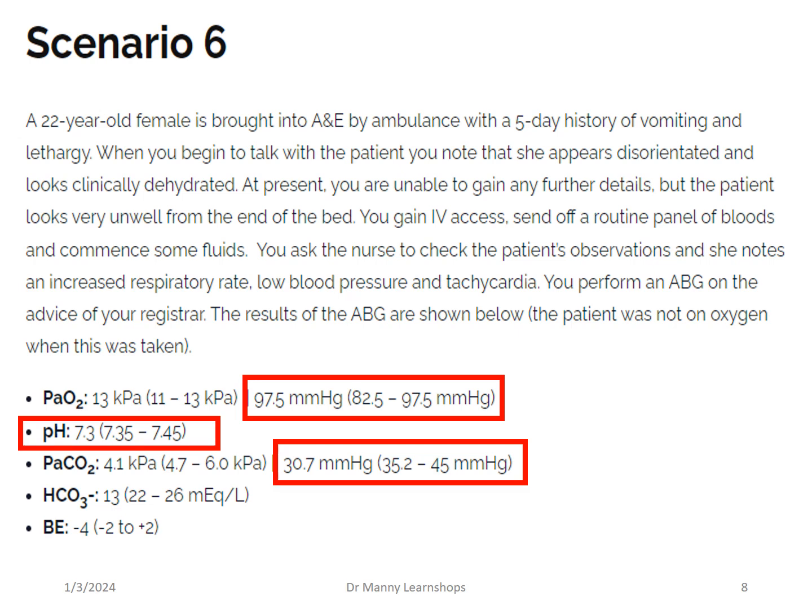They're breathing quickly. When you look at the bicarbonate, it's low, indicating acidosis. Bicarbonate's being used up for some reason. And the base excess is low, indicating acidosis. So what's your interpretation of this blood gas? I'll let you think about it for a moment.